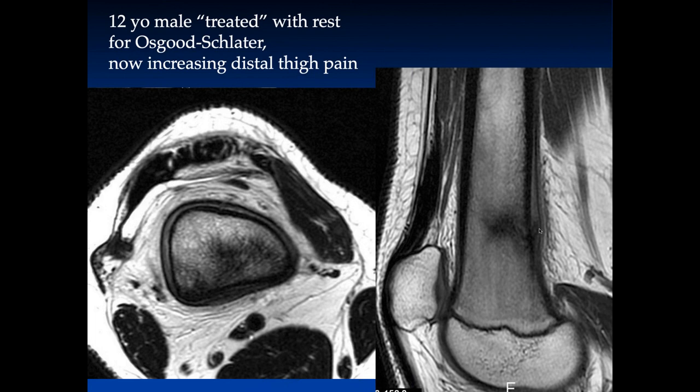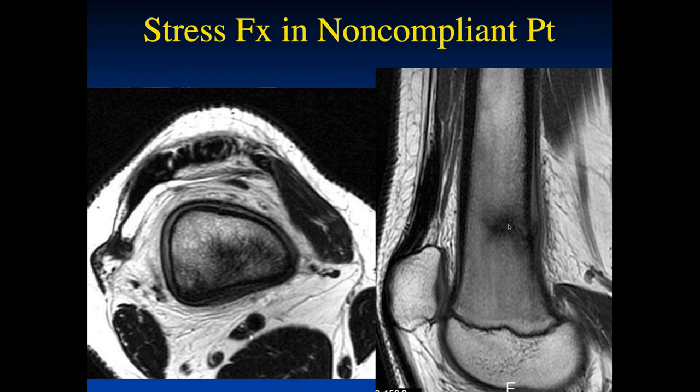So this was a teenager who was supposedly on rest, but it turned out after this happened and they got increasing pain, they finally confessed that they were out playing sports anyway when they weren't supposed to be. And this actually was a worsening stress fracture due to noncompliance on the part of the patient. Yeah. So that's an incomplete fracture.